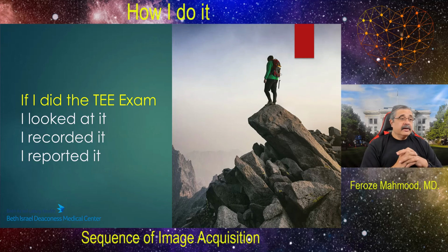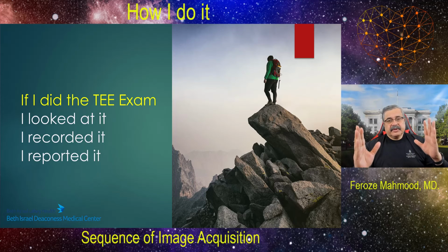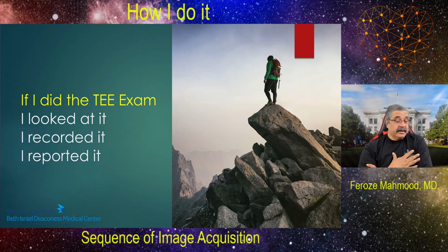So at the end of the day, I didn't want to give too long a presentation about the nuances of a comprehensive exam, but exactly the specific sequence of the exam, the way I do it. And the lesson that I learned is that the threshold of each examination should be, if I did the TEE exam, I looked at it, I recorded it, and I reported it.